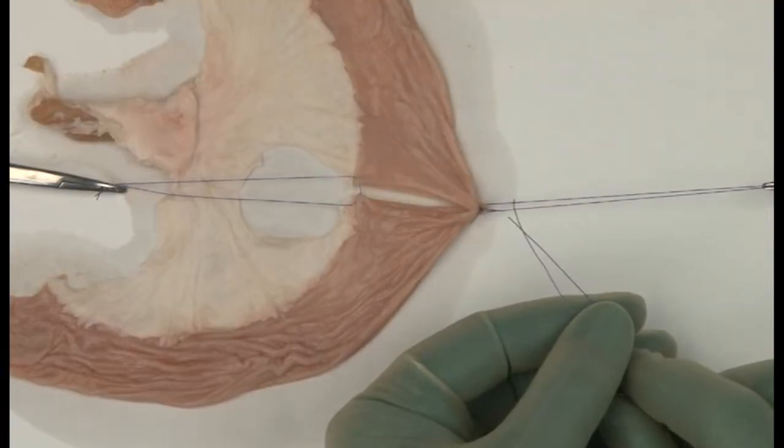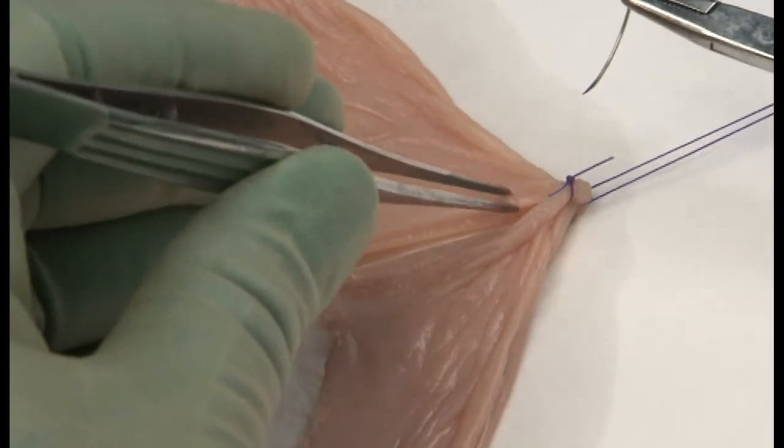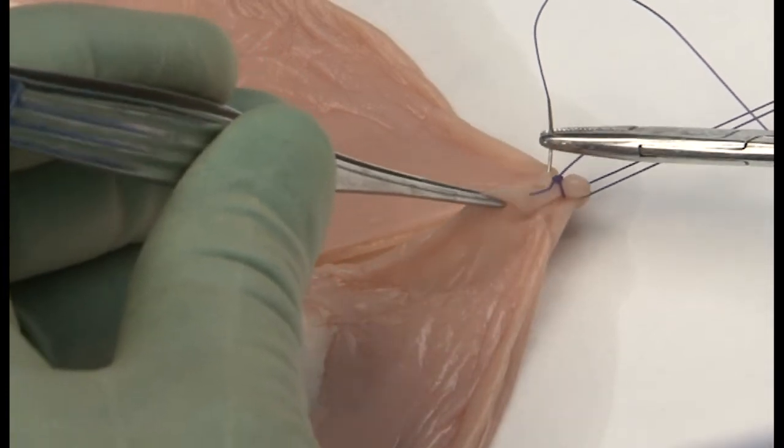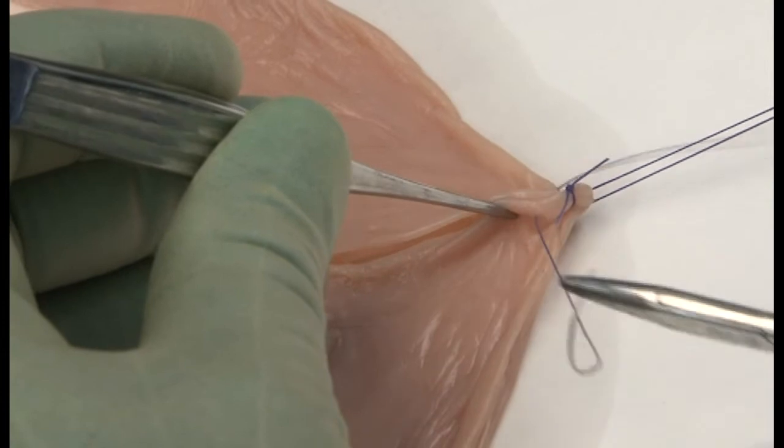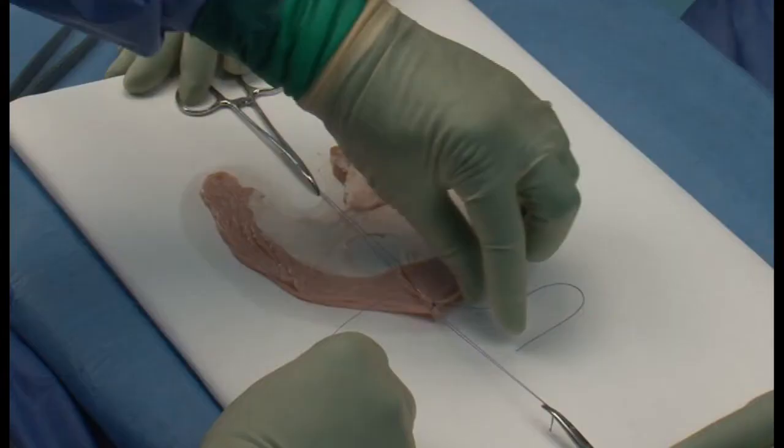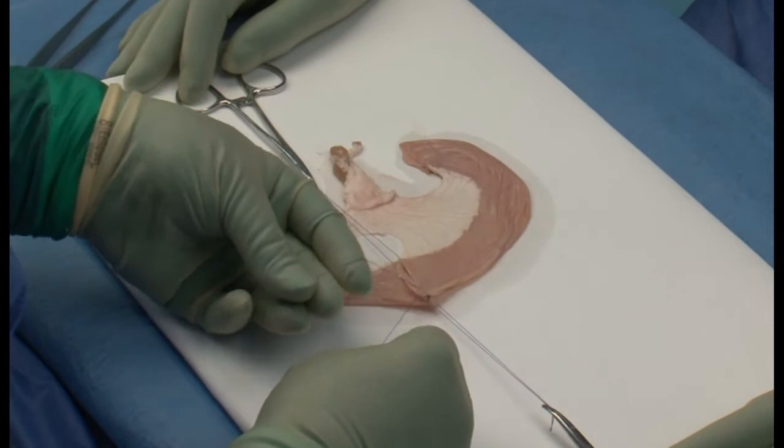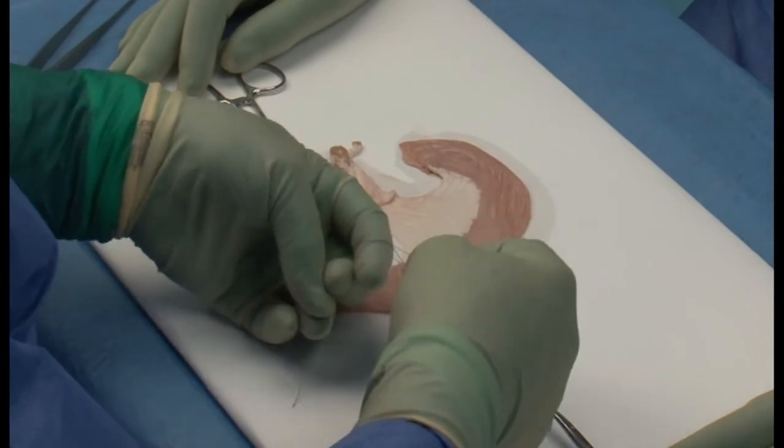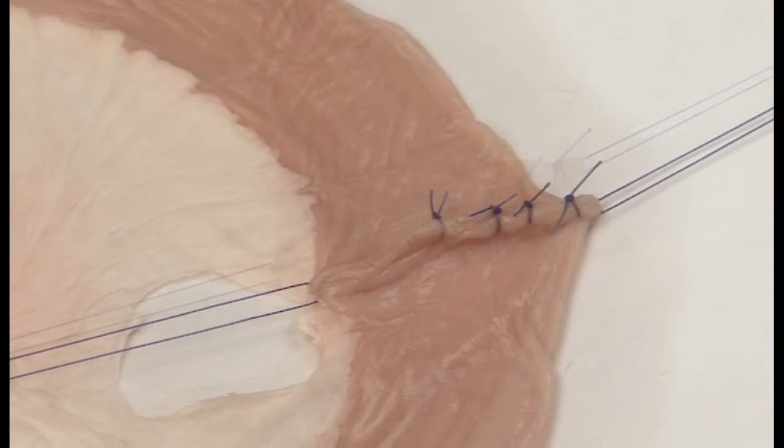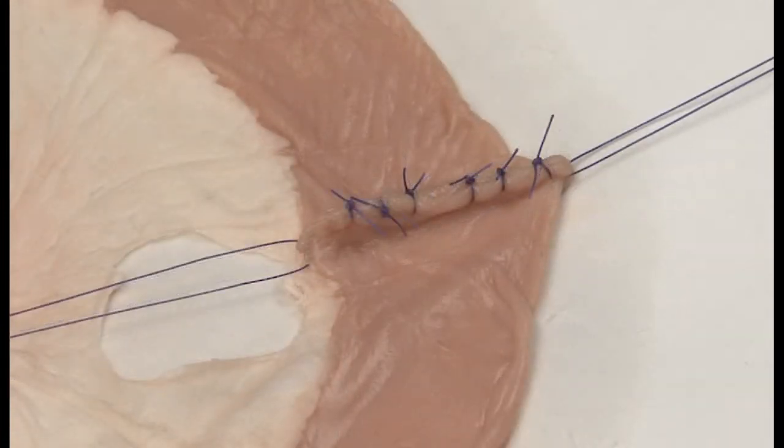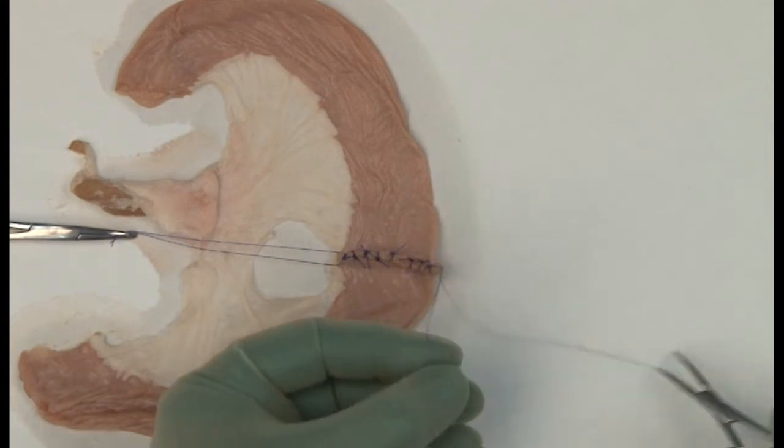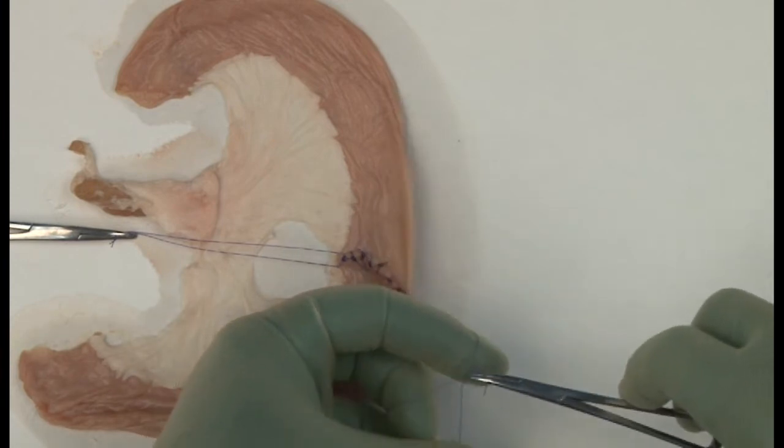Cut the ends about 4 mm long. Work across the entire anterior wall at 5 mm gaps. But do not cut them. Replace them in the hemostats.